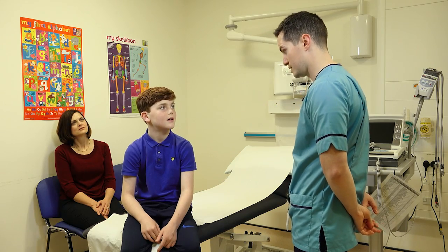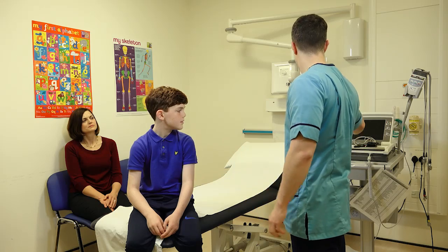Why would anyone need this? Well, the doctors like to know what your heart rate and rhythm is like, not only in the hospital but when you're out and about as well. Is it going to hurt? No Sam, not at all. All I'm going to do is attach these electrodes to you.